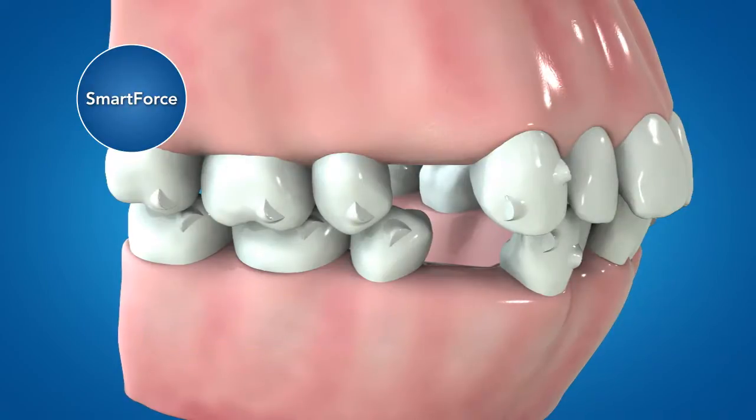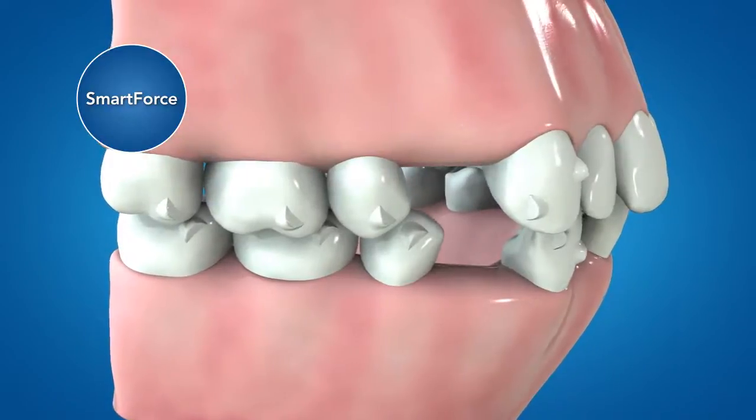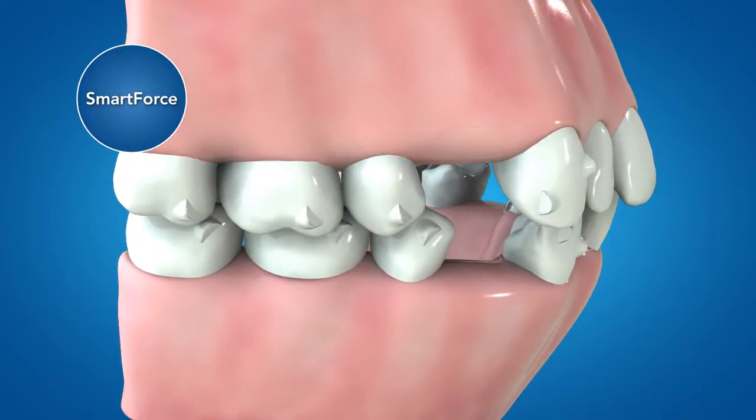Even though this solution is designed for maximum anchorage, up to two millimeters of posterior mesial crown movement is possible in the ClinCheck treatment plan to fine tune the occlusion.